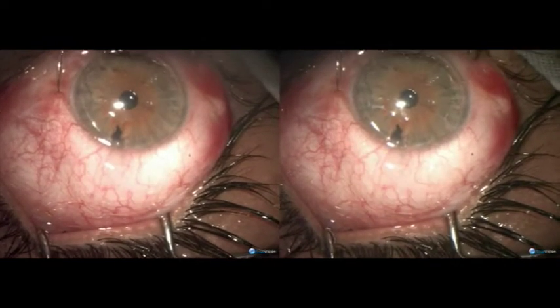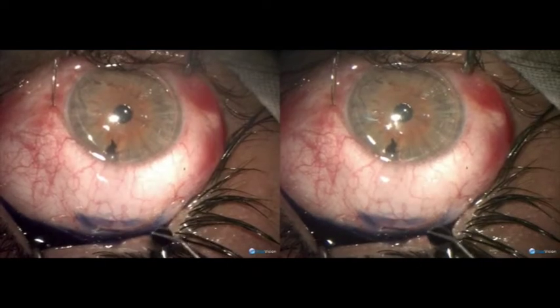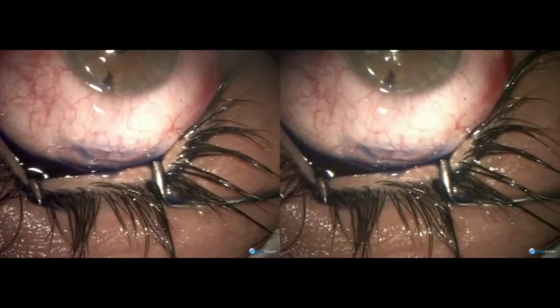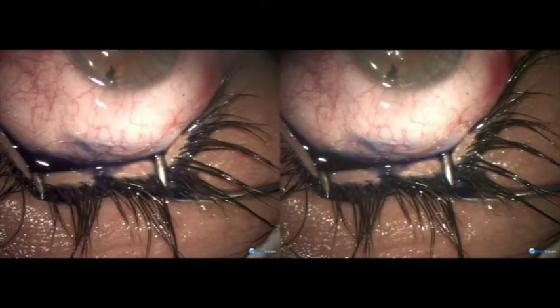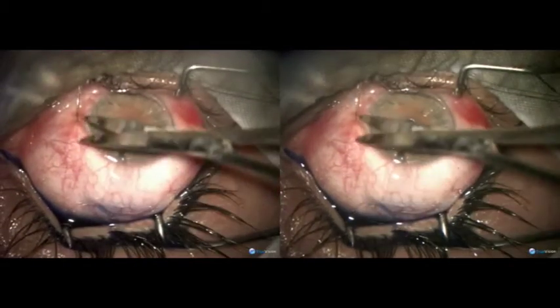The conjunctival holes are far away from the filtration area. Although at the moment fluid is moving out of those holes, they do not need any suturing. Therefore, that is the end of surgery.